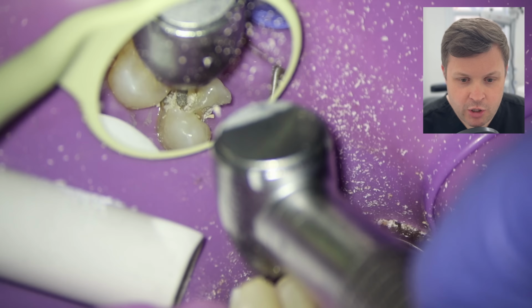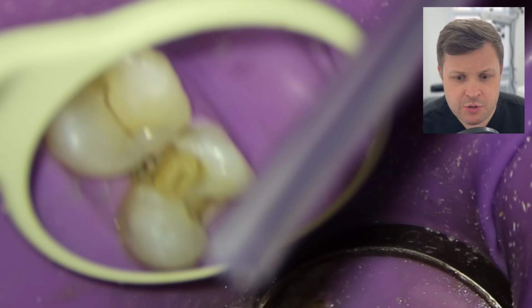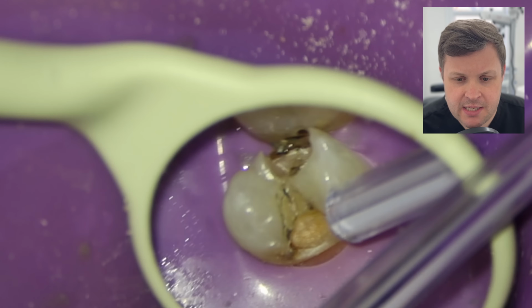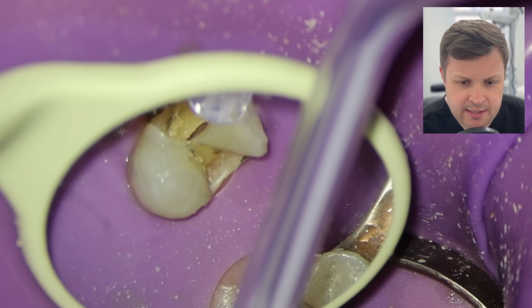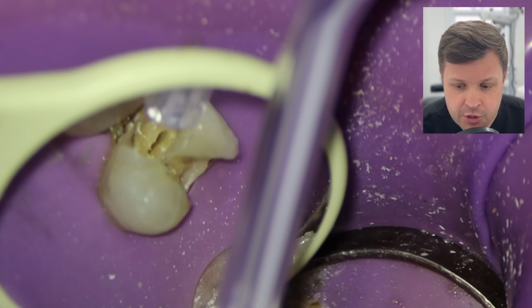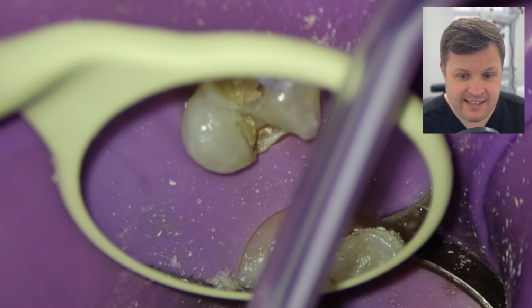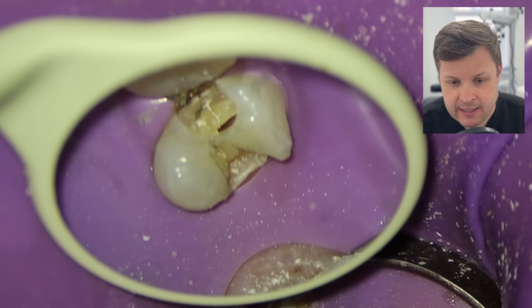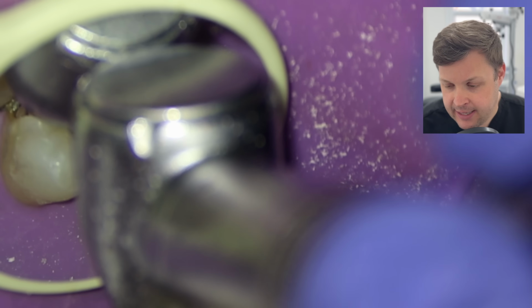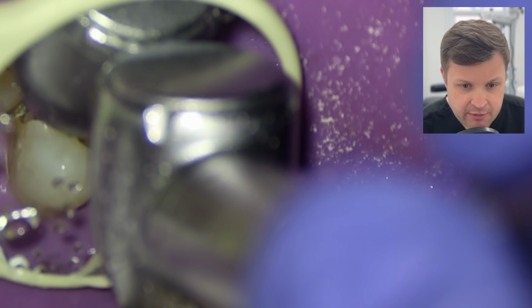And we have a close look at this tooth now once all the decay and the fillings are removed, and we can see there's quite a significant bridge which has been kept between these two teeth. So I'm thinking, I want to try and keep this bridge of dentin and bridge of enamel, because it helps with the structural integrity of the tooth. Although I think straight away I'm aware that the access on this tooth isn't perfect. So we're doing a little bit more refinement of the filling and the tooth, getting rid of all of the old filling and all of the decay, and just having a little feel around.